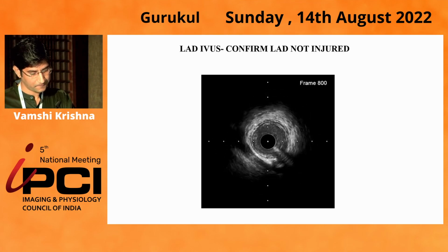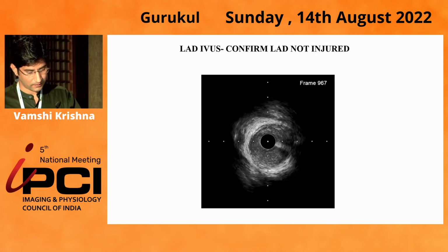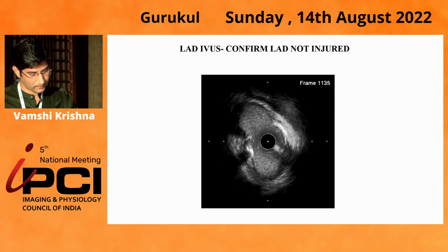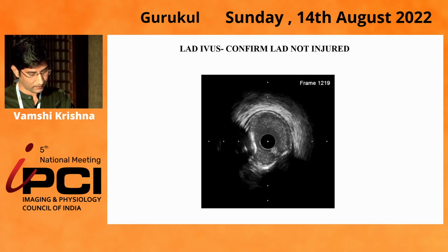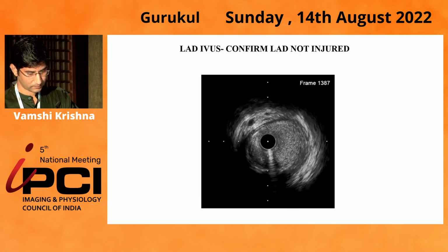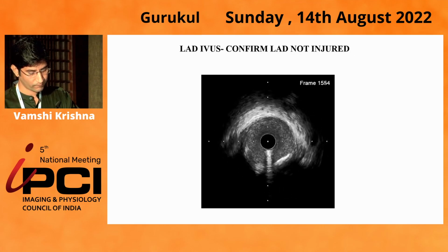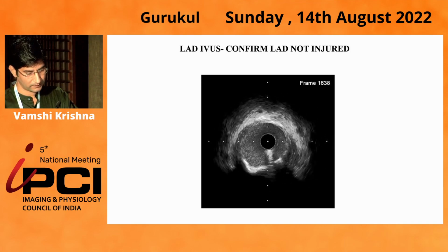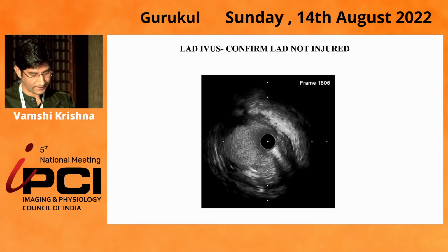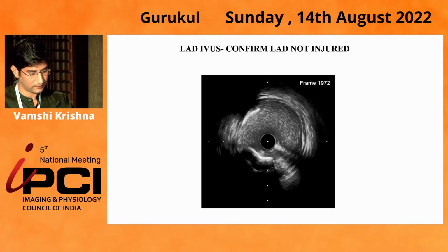There is mild disease and minimal plaque at 12 o'clock to 1 o'clock position, and some calcium at 8 to 11 o'clock position. And mild calcium again at 5 to 7 o'clock position, where the LCX is joining into the LAD. There is no significant disease.